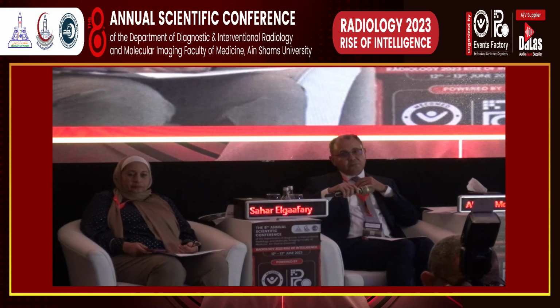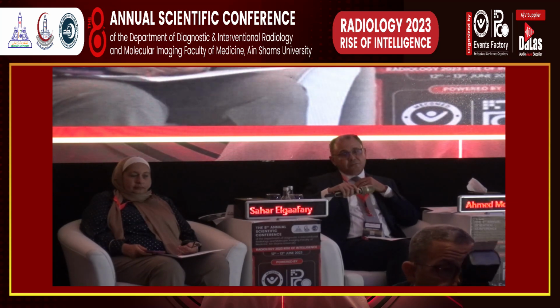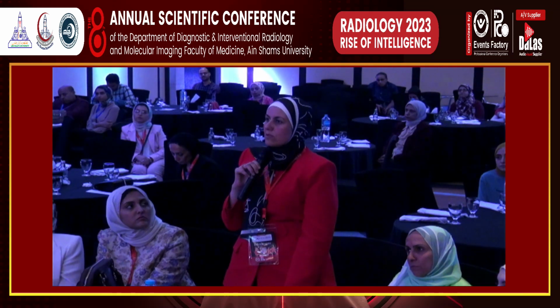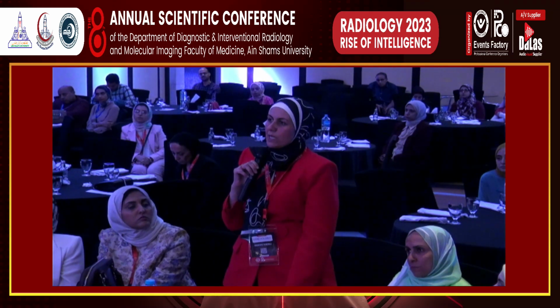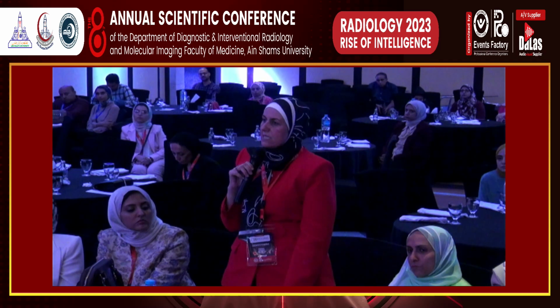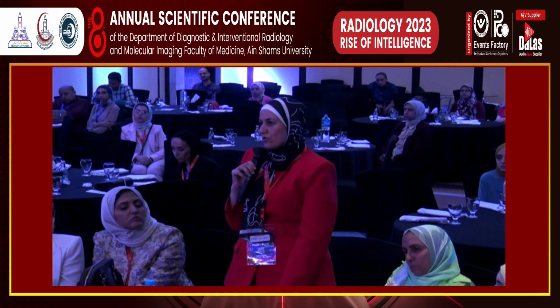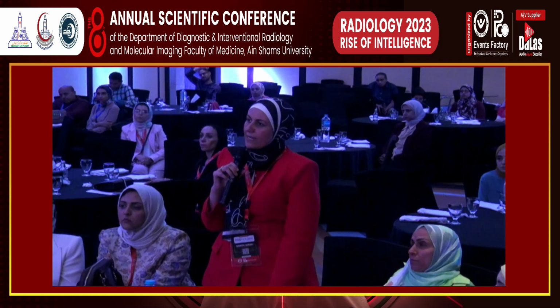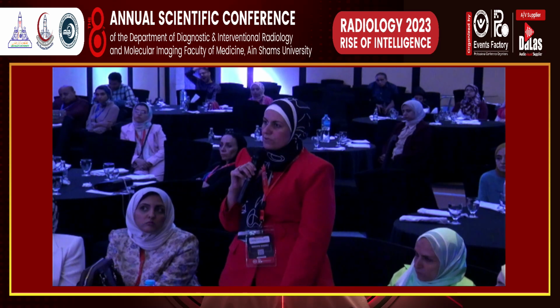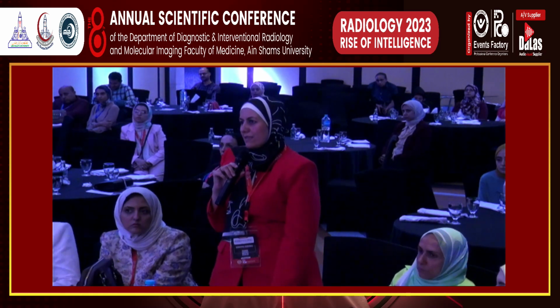طبعا بقى لو في كونترا إنديكيشن أصلا للكونتراست إنجكشن في السي تي، فمش هيفيدني في حاجة إن أنا أعمله non-contrast. ممكن أكتفي بالنون كونتراست MRI هيديني بروبر إيفالويشن، خاصة إن أنا عندي البانكرياتيك بارينكيما ممكن إن أنا أشوفها سيميليتنج الإنهانسمنت في البري كونتراست T1، فهيديني داتا أكتر من اللي هيديها لي النون كونتراست سي تي. فدول الإنديكيشنز. أو إن أنا بعمل بروبر بلاننج وأنا خايف يكون عندي ريسك أوف هيباتيك ميتاستاسيس. لو في suspicious لهيباتيك ميتاستاسيس I go for MRI for the hepatic not for the pancreatic lesion.